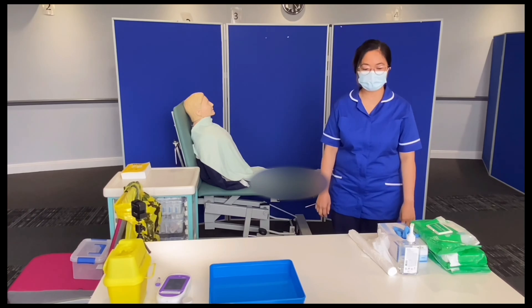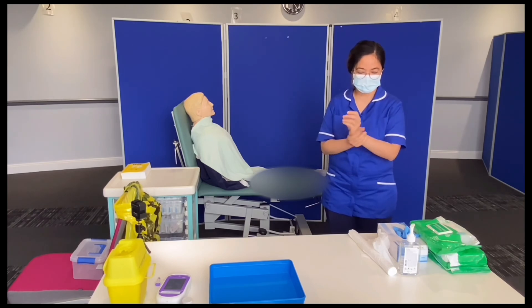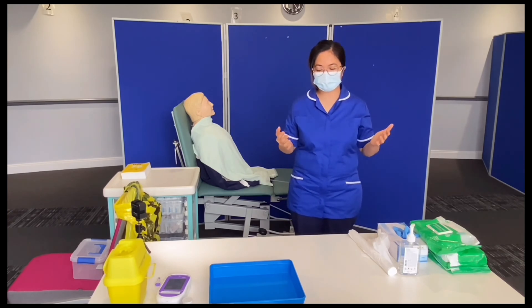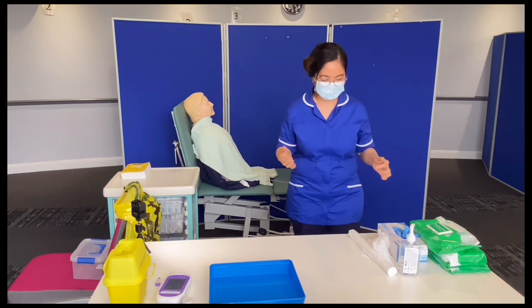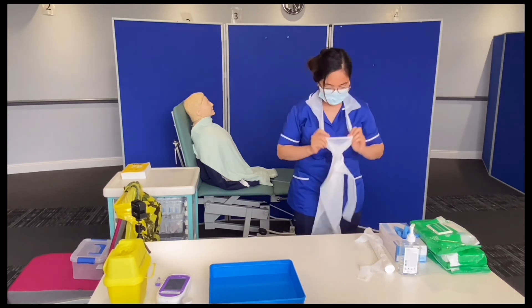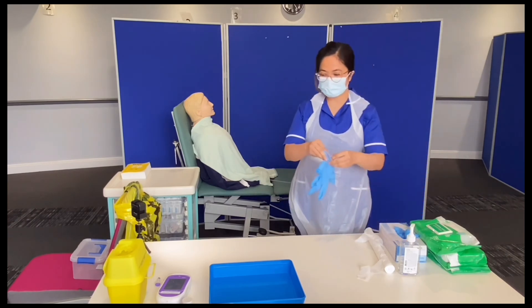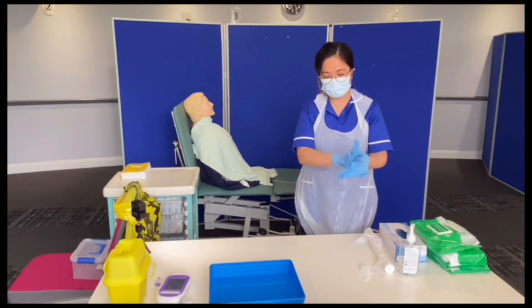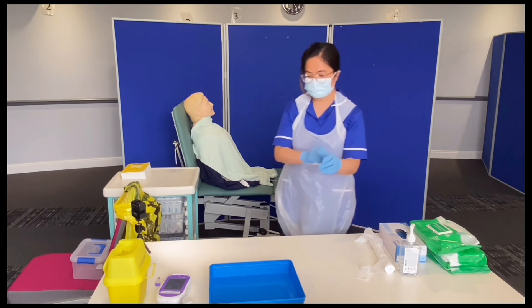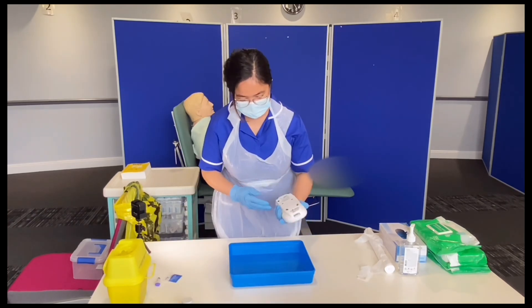I'm going to prepare my equipment for the blood sugar check. I need to do my hand hygiene as per the WHO 7 steps of hand hygiene. I'll wait for my hands to be dry. Can I quickly check if my tray is reusable or disposable? — Disposable. I'll put on my apron. My blood glucose monitor has been calibrated within the last 24 hours. I can see the tray is clean and dry.